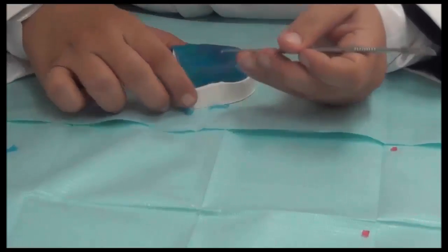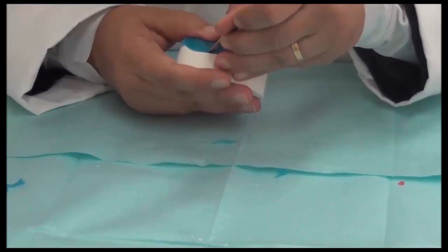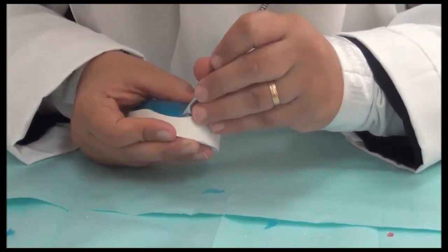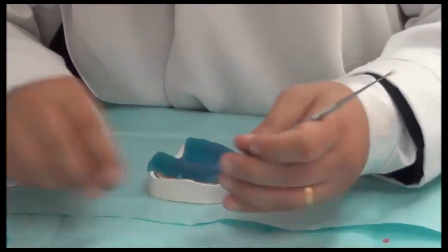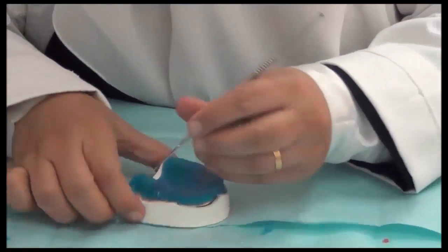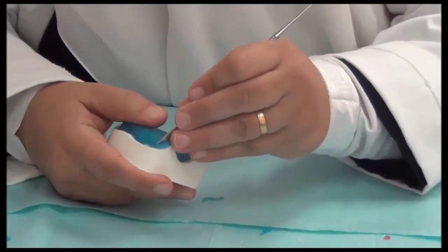Once we have all of the material in location, the material is adapted, and now we can cut to the line that we have drawn, which is 1 to 2 millimeters away from the sulcus. We're following the line, it's drawn 1 to 2 millimeters away from the sulcus. And we're removing the excess once more. We have the material inside the hamular notch, straight to the other hamular notch area. So it's included in the borders of the tray.